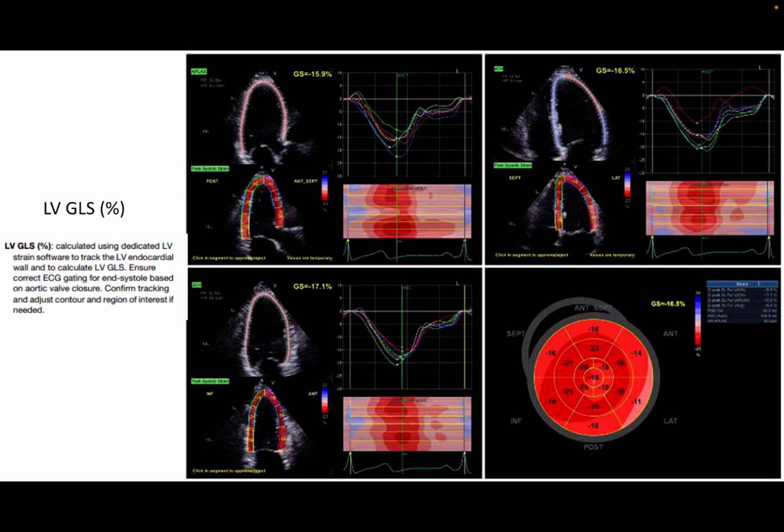Teaching pearl. When you see a patient with a normal EF of 55, grade 2 diastolic dysfunction, GLS of less than 14, and a basal strain worse than apical, think amyloidosis. Order PYP scan. This pattern should never be casually labeled as hypertensive heart disease.